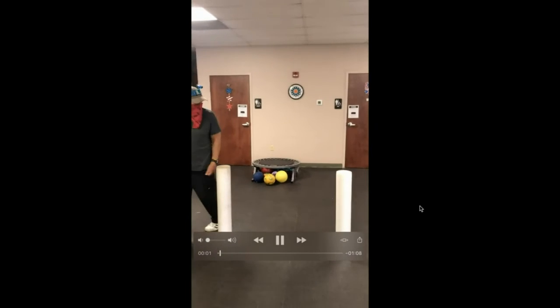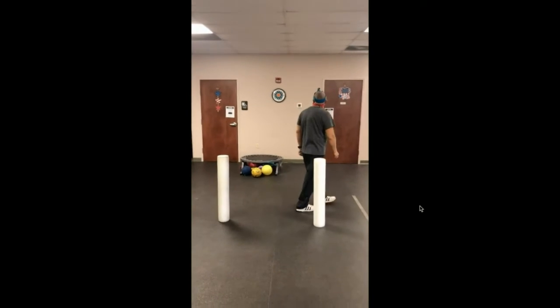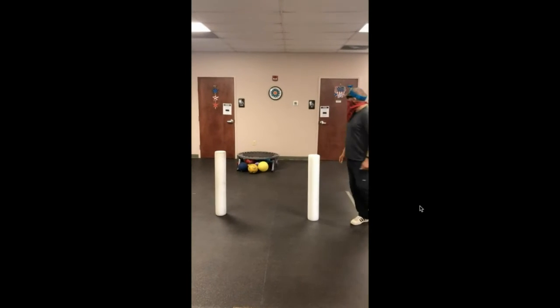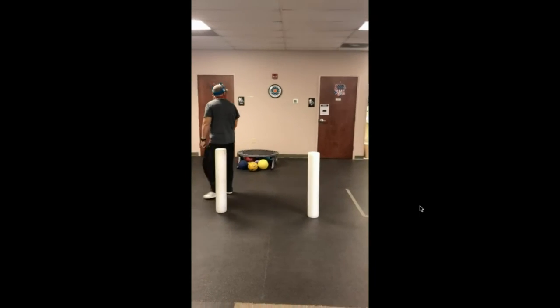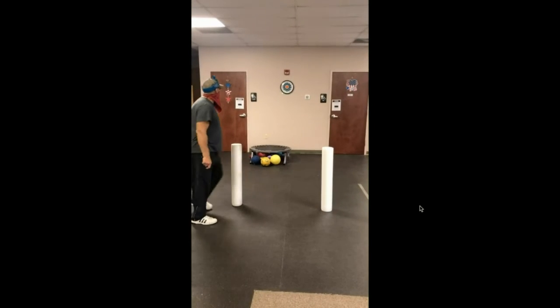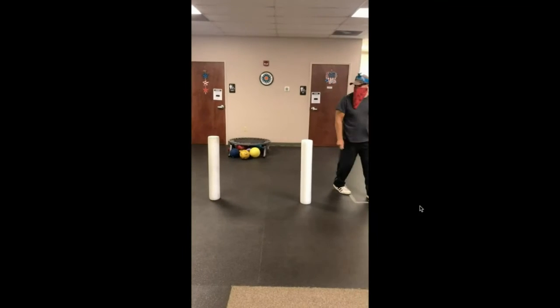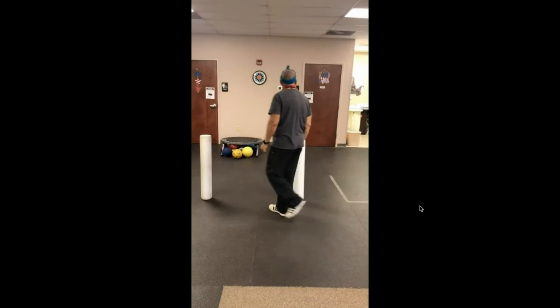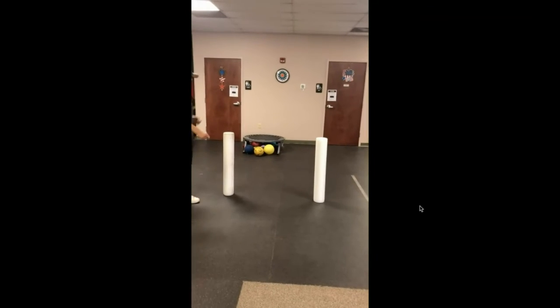So if we play this, you'll see here, as he moves through again in the infinity pattern, he keeps the laser on the target as long as he can, and then he'll take his head away. So it goes through a large cervical excursion and a body rotation there to come back. So this is the task. And you'll notice a few things on this task as we run this through, and then we'll back it up again.